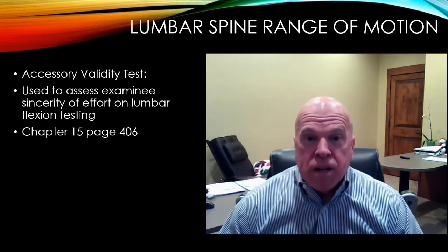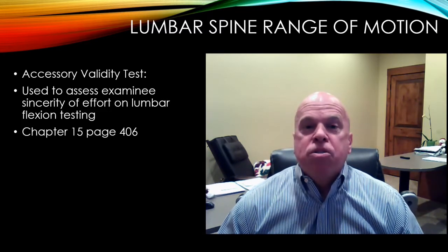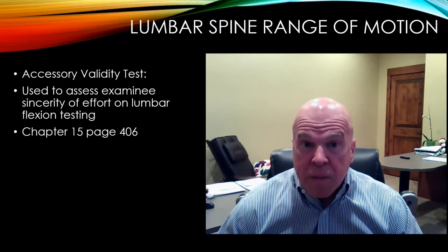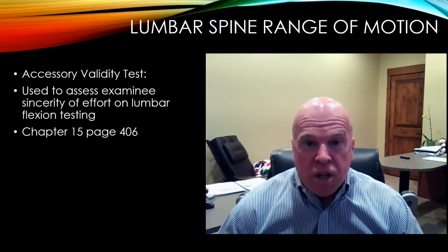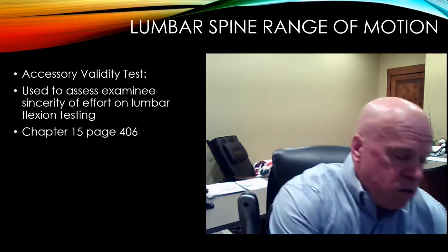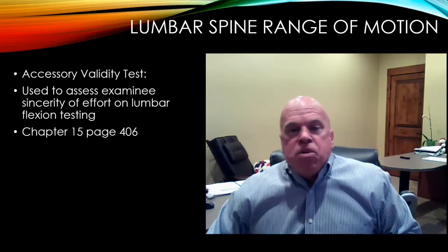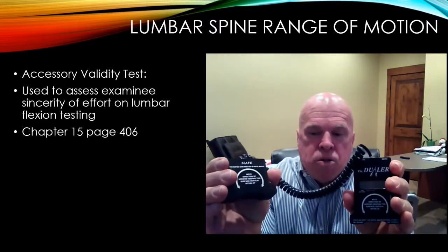Now, qualified medical evaluators tell me that they don't have the inclinometers that are described in the AMA guides. And I'm here to tell you that you must obtain inclinometers in performing your range of motion testing of the spine. So there are many different types of inclinometers available on the market. These are my inclinometers here.